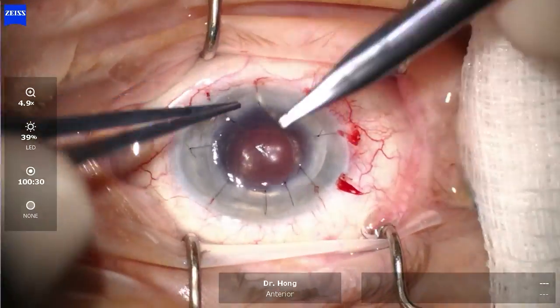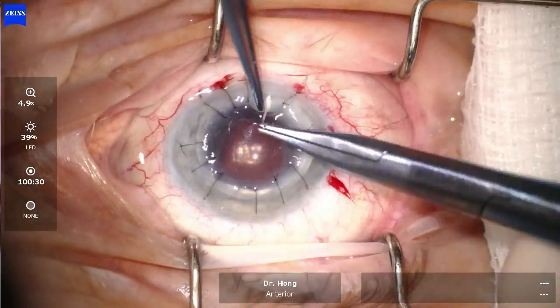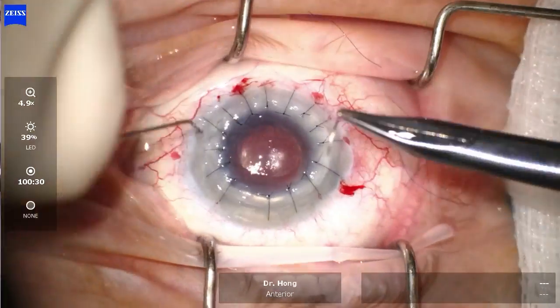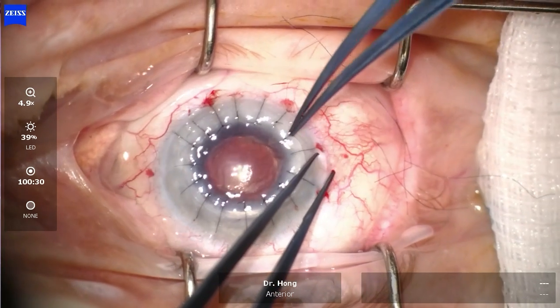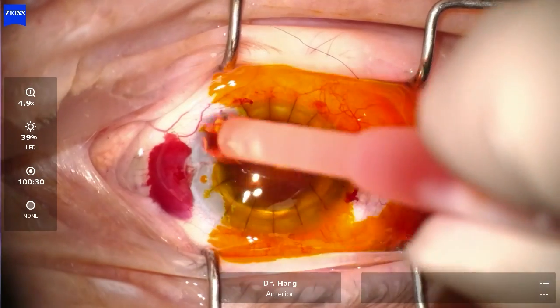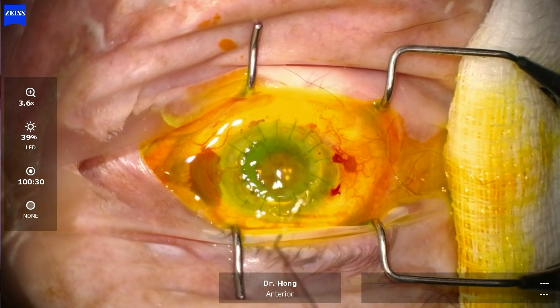This part of the video was sped up by at least 10 times, but the principle is to place 16 interrupted sutures and to spread the tension equally. The suture knots were then rotated and buried. Placido disc was used to check for equal tension and control of astigmatism. Fluorescein was used to confirm there are no leaks, and antibiotics were then given at the end.